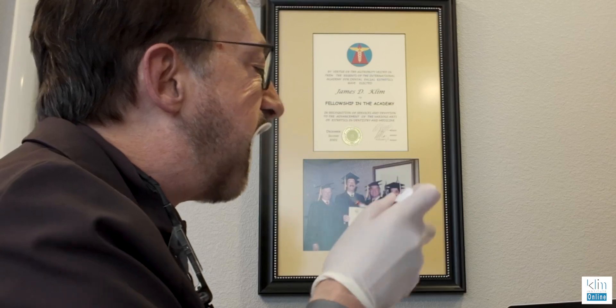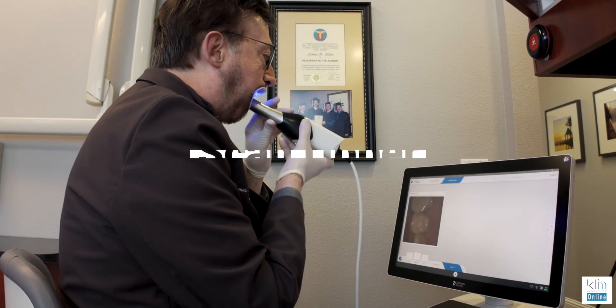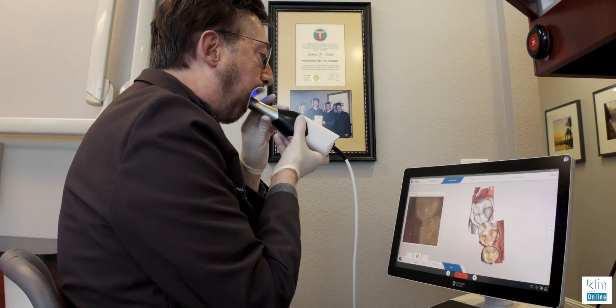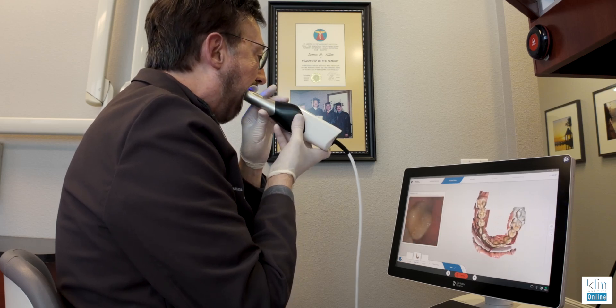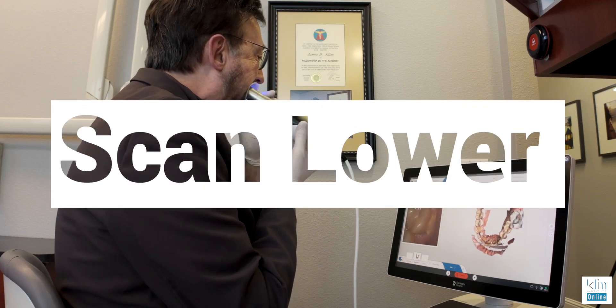So I'm going to start my scan here. I still use a little bit of OptiSpray just to cut down on the reflection. I get a much quicker scan this way. It's fast, saves time. It's a smaller file.